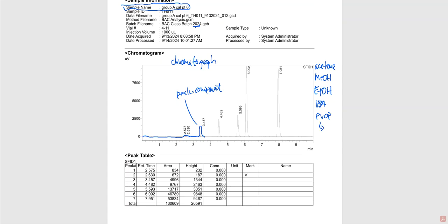The prop was the same amount into every single flask. There were no changes at all. We made a master standard, and that standard was diluted down, and then we diluted into each single headspace vial. And the purpose of the propanol was an internal standard.